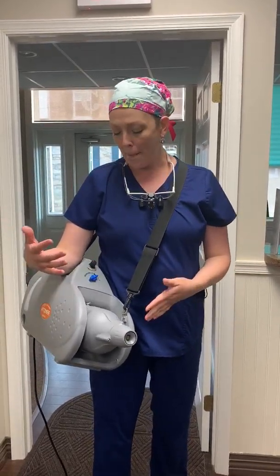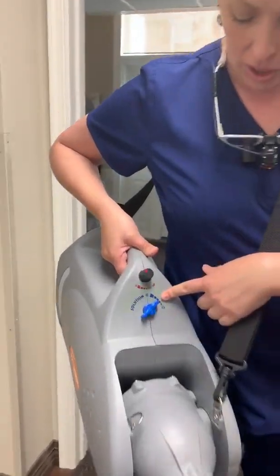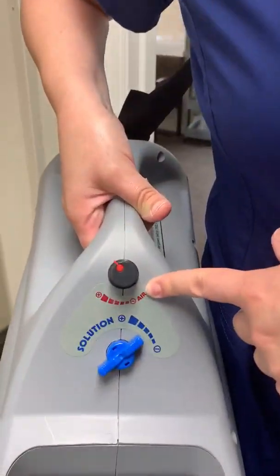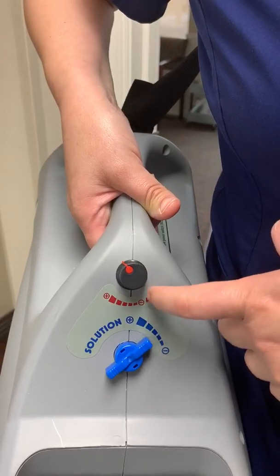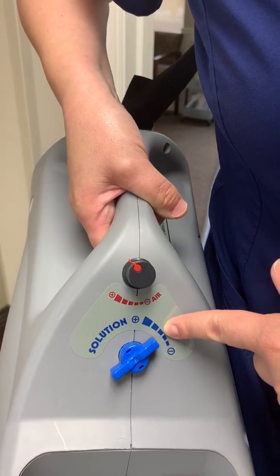Everyone still wears their mask — I'm clearly not wearing one right now just because I'm trying to talk to you. There are two buttons: one is for solution concentration and one is essentially the power or the force. We keep it between a 2 and a 3 because that gives a good mist.